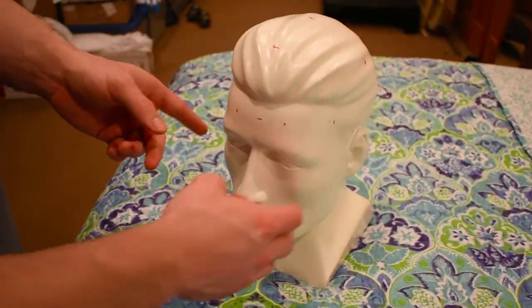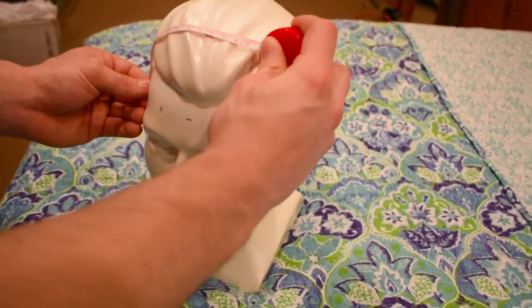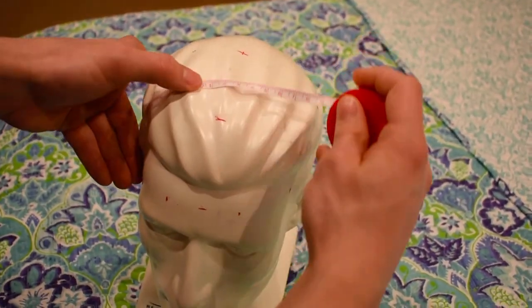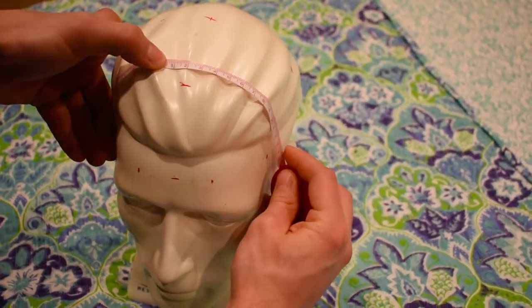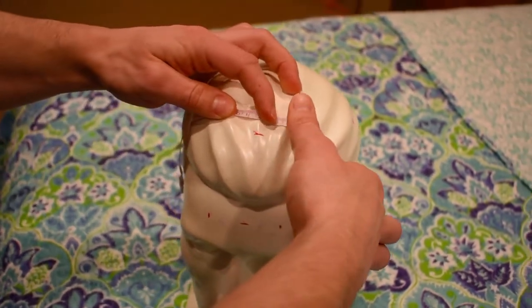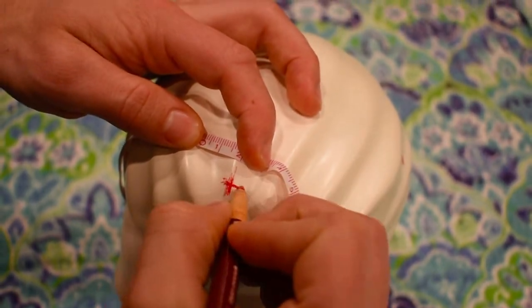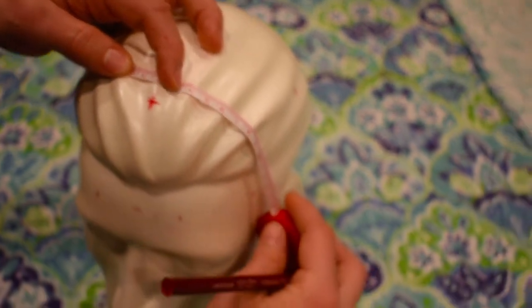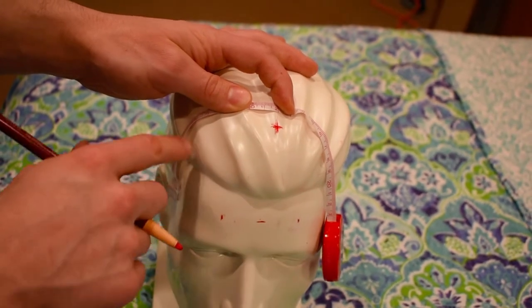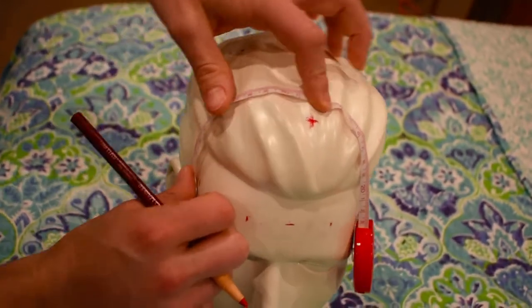So the markings that we made for F7 and F8, we're going to measure through our marking that we made for Fz, and it comes to 24 centimeters. So we're going to measure halfway, which is 12 centimeters, to get our final marking for Fz. And then we're going to measure 25% of that 24 centimeter measurement to get our marking for F3 and F4. So we're going to go ahead and do that.